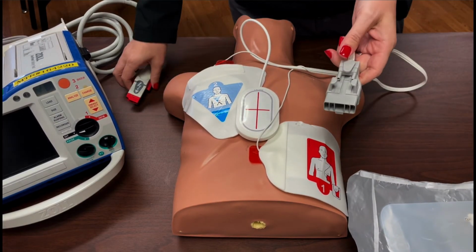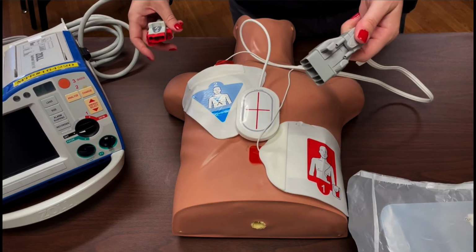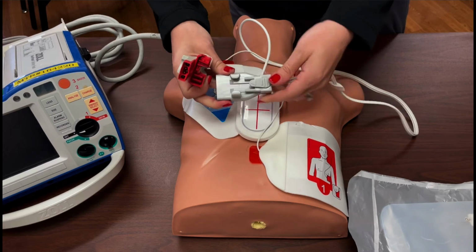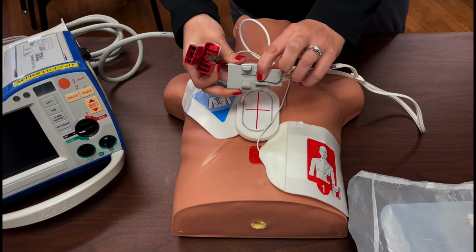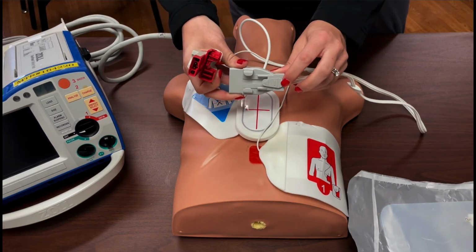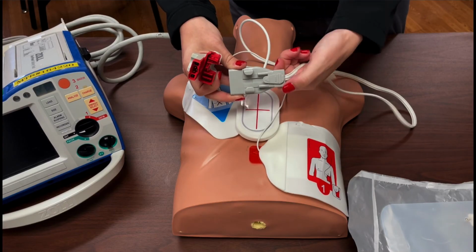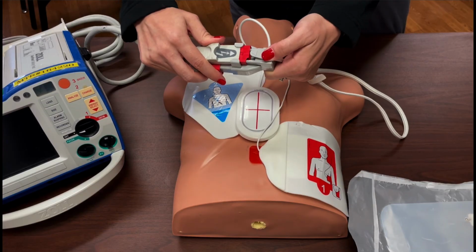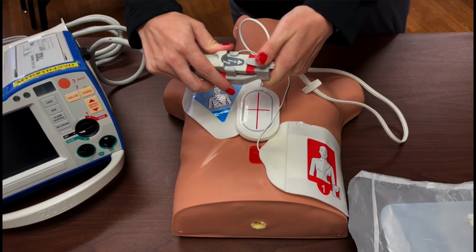To connect the pad, you're going to take the piece from the pads and the connector from the Zoll, and on here you have a little triangle and you have some series of straight lines. You're going to place your thumb over the straight lines to lift the connector piece and then slide it into place with the Zoll.